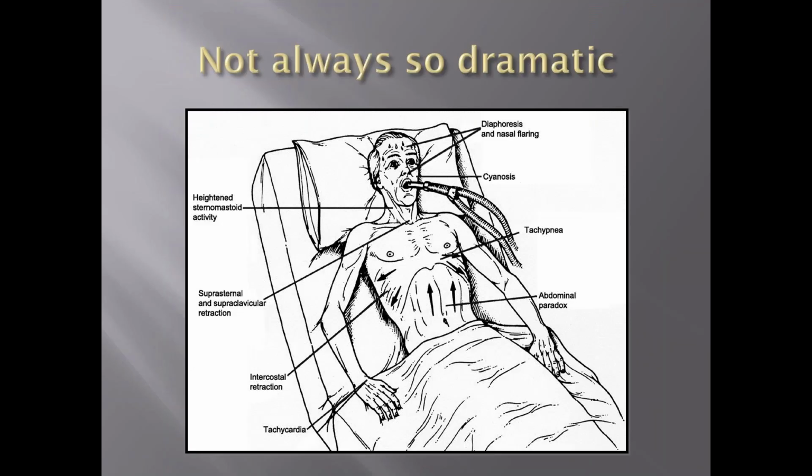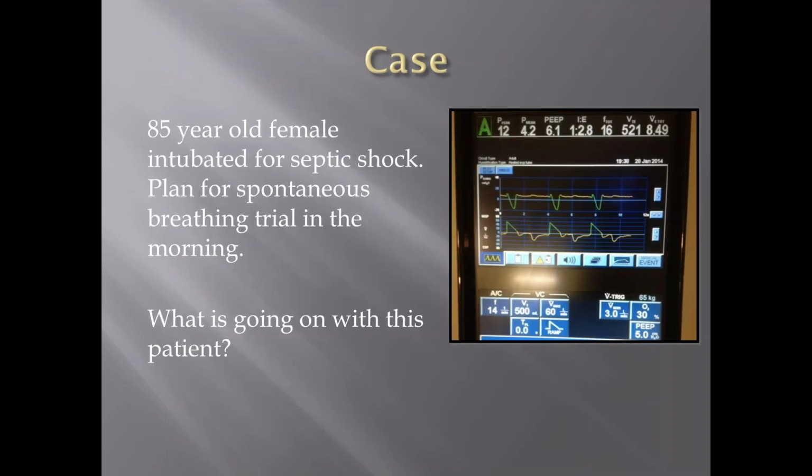This is all about gas delivery. This is a picture I showed you before, but I actually had a patient I took care of where these were their waveforms, and you couldn't tell that they were working very hard. What do you think of these waveforms? The pressure waveform, is it staying above CPAP? It's completely negative, right? So the patient is on positive pressure ventilation, but actually they're breathing with completely negative pressure. They're making an enormous effort to breathe, and we don't see that infrequently.